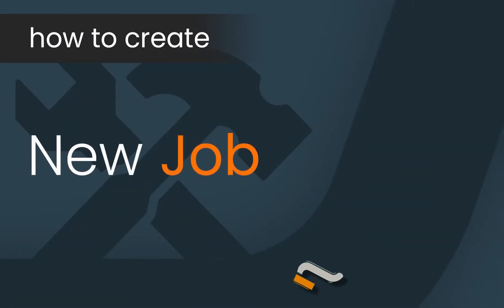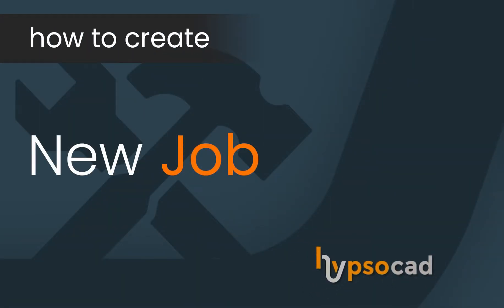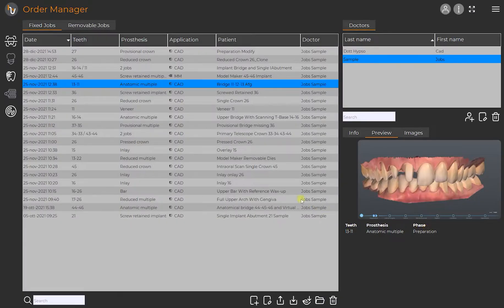New job. In this video we will look at the definition of the job for a reduced crown on tooth 26.